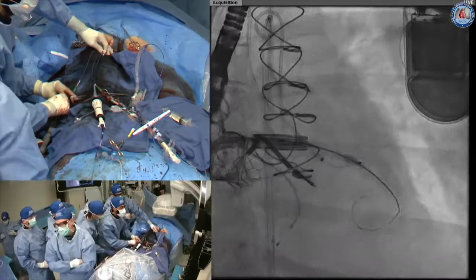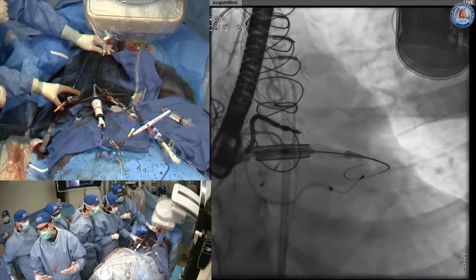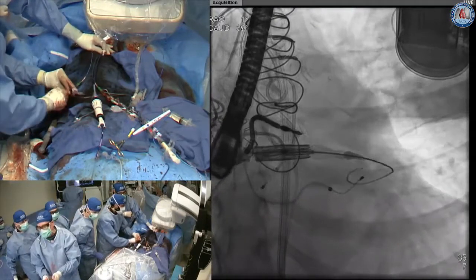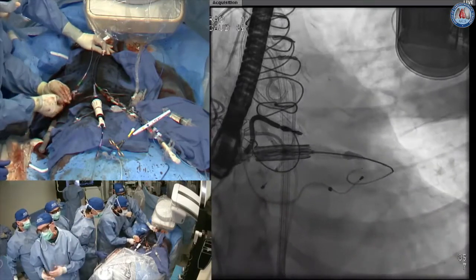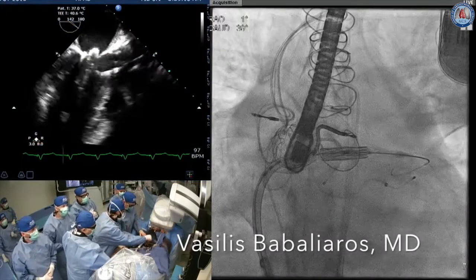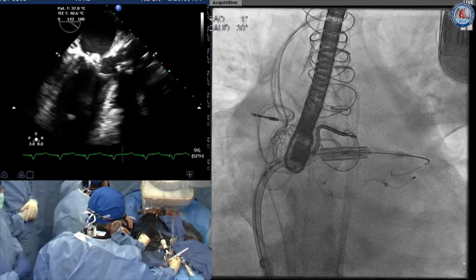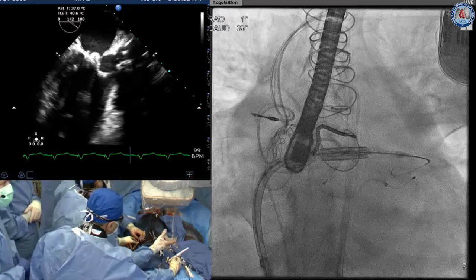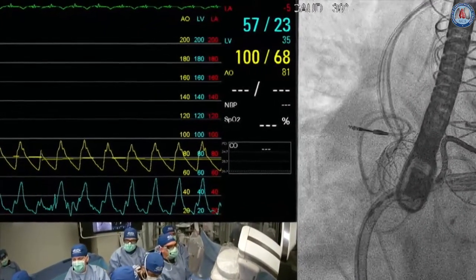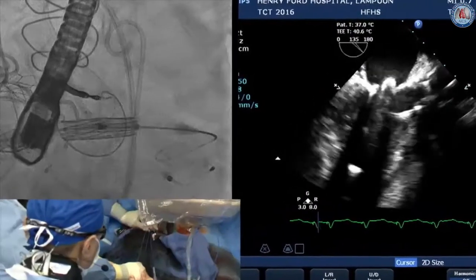We don't tighten until we're ready to create the laceration, because we're going to create torrential MR when we lacerate the leaflet. We want to make sure we can deliver the valve no matter what. In all seven cases done so far, a valve has gone transeptal through the ring or through the valve and back out into the atrium, so we know we can safely deliver the valve within 10 to 20 seconds if needed. We have pulled a little bit tight on the anterior leaflet to get ready to burn, which causes a little bit of MR. Our V wave, which started around 35-40, is now up to 57 due to tensioning. We're going to do a gentle burn and pull back on the LA catheter just to tighten it up a little.